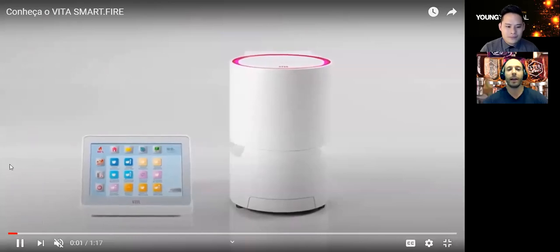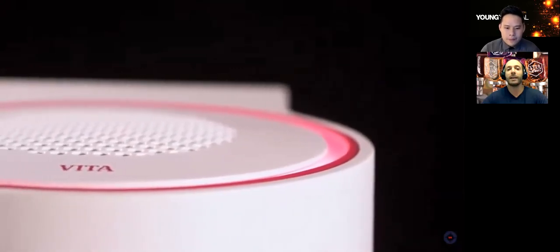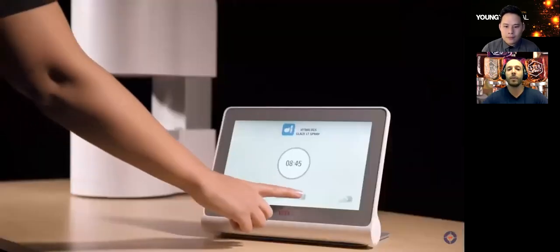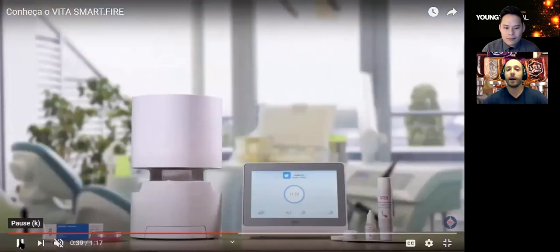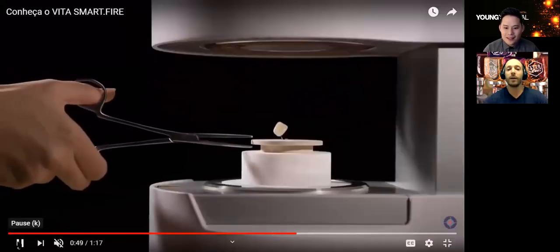This SmartFire oven, for its capacity, is extremely small and powerful. I really like the fact that it doesn't take up a lot of counter space. Also, the control pad is separate from the furnace, so you can really get it to fit into your office or mount the screen on your wall. It's designed to be used just like an iPad or an iPhone. All of the Vita programs for our materials are pre-programmed into the machine, in addition to other competitive materials, which makes it unique.